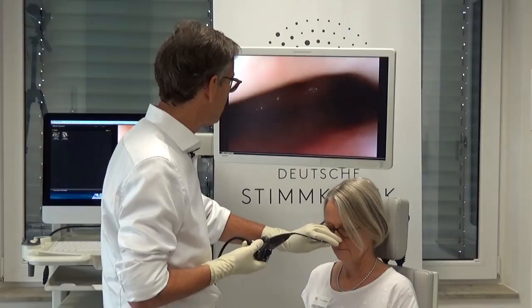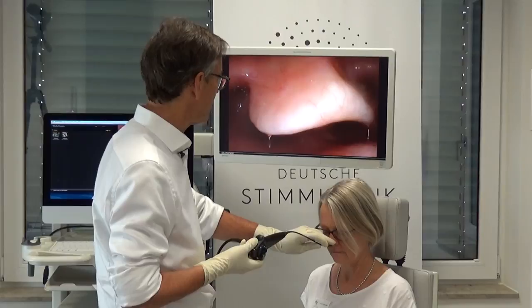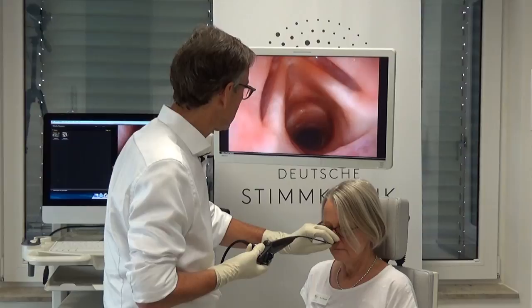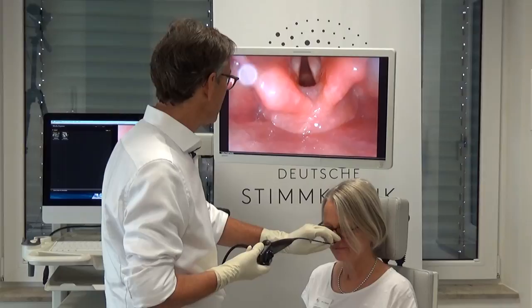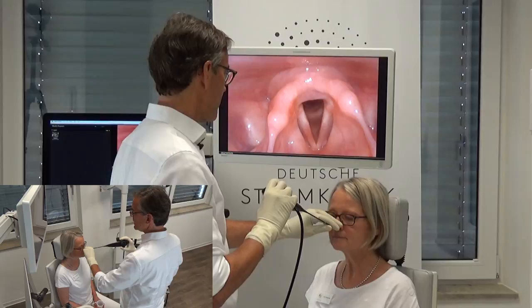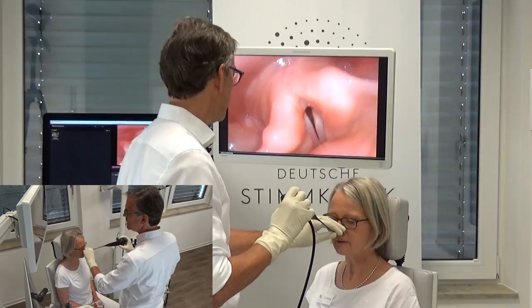I can't go through here because I would probably elicit a gag response. But what I can do is ask her to phonate, then advance the endoscope. Now give me a long inspiration — I can see the trachea, but I did elicit a gag response because this is the most ticklish advancement of the endoscope. So last time: exhale through the mouth and now inhale.